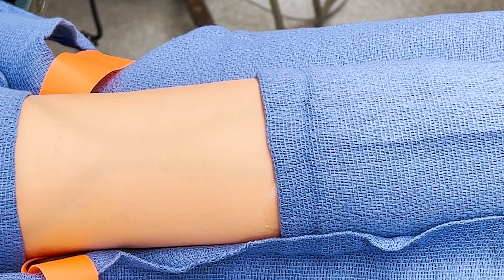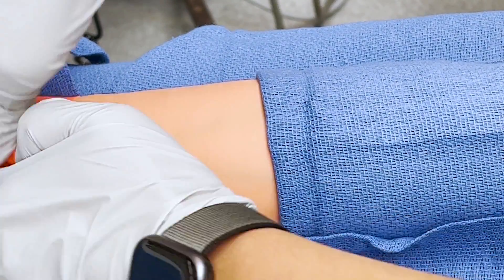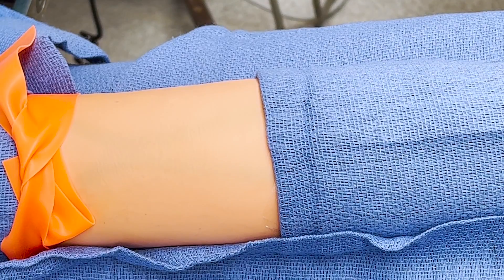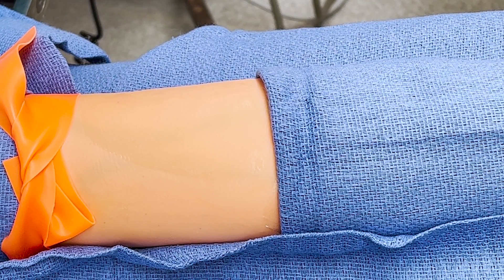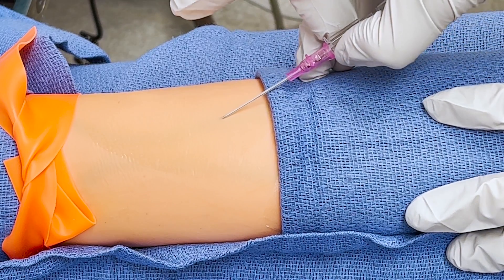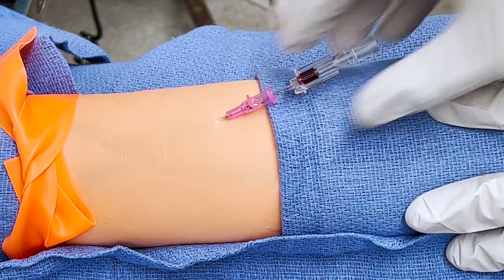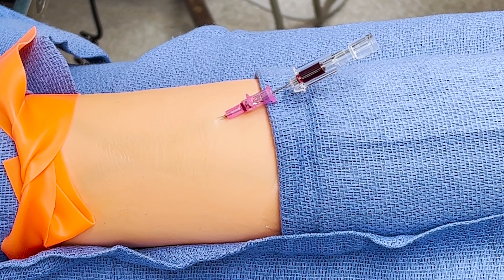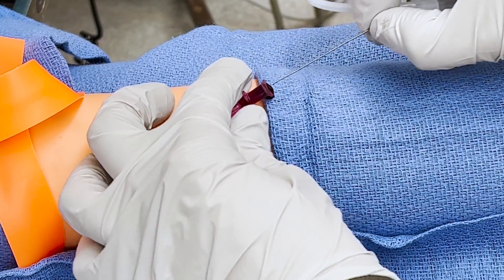Here, my colleague Dr. Alzara will demonstrate proper RIC line placement. First, place a tourniquet on the arm and select a large vein. Clean with antiseptic. Place a 20-gauge intravenous catheter by whatever technique you prefer. After successful IV placement, insert the guide wire.